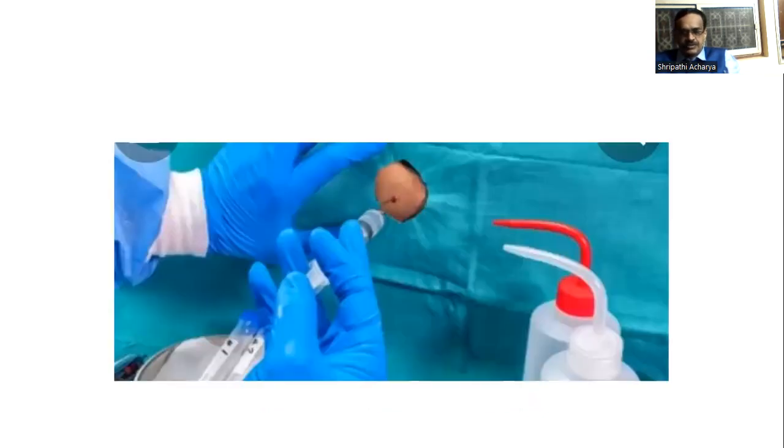The area of prick, disinfection is done. Then we are giving the injection of lidocaine for local anesthesia and after that we are puncturing with the spinal needle.